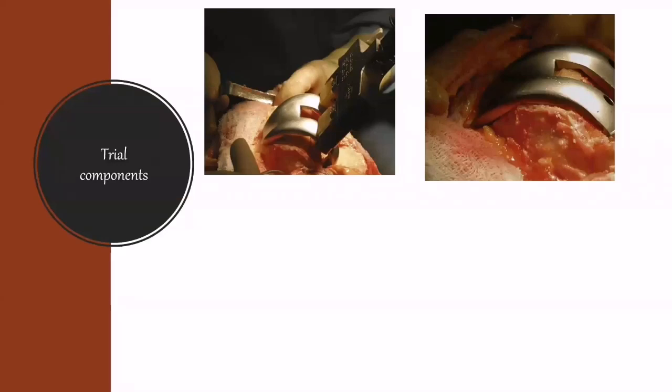So how about the tibial trial component? After we finish all of them, sorry for this connection. Okay, now we will start the trial component after resection.